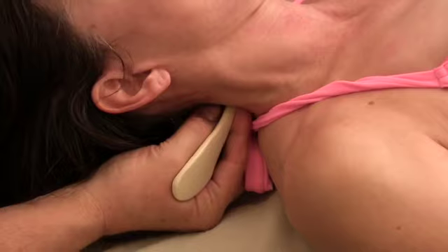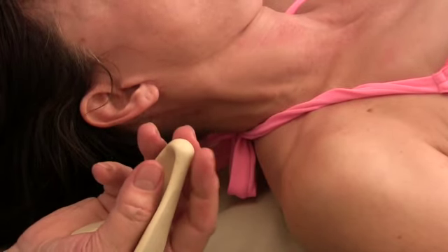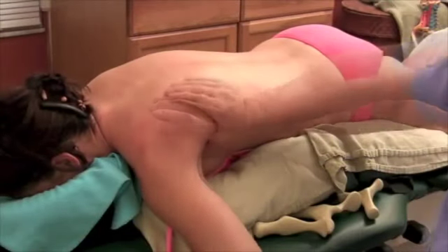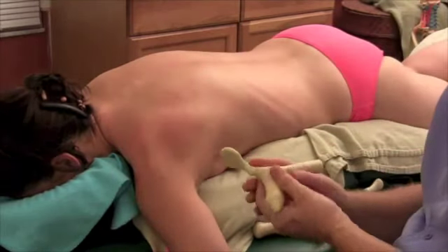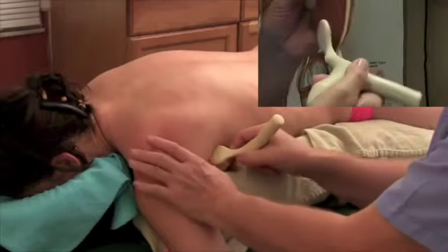This finger is feeling the spinous processes and this one is sensing the transverse processes. Into the subscapularis — how difficult that is on your thumb on those people. That's where the spoonbill tool comes in. It is just a dream come true.